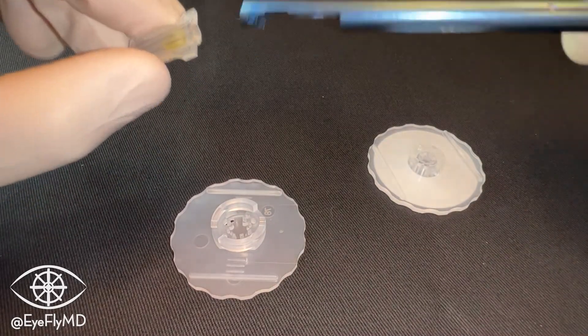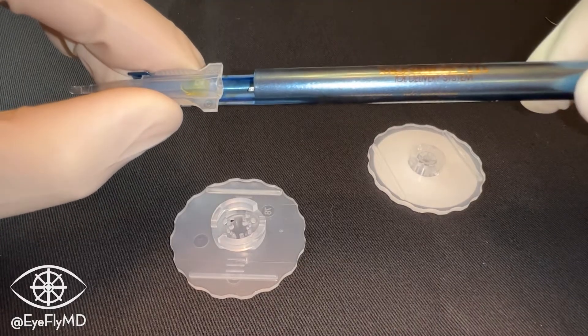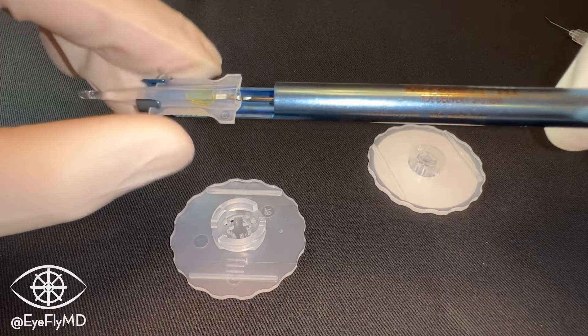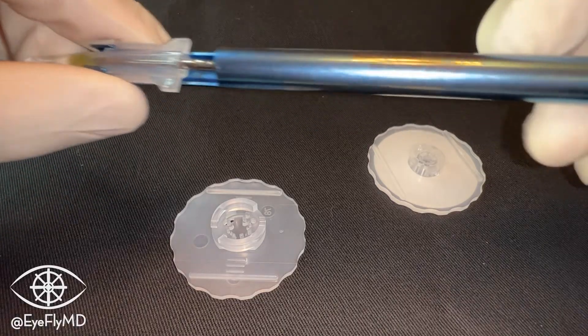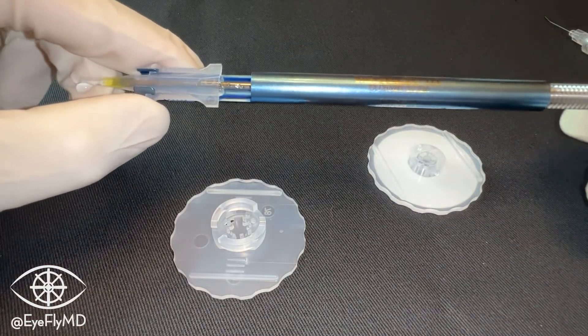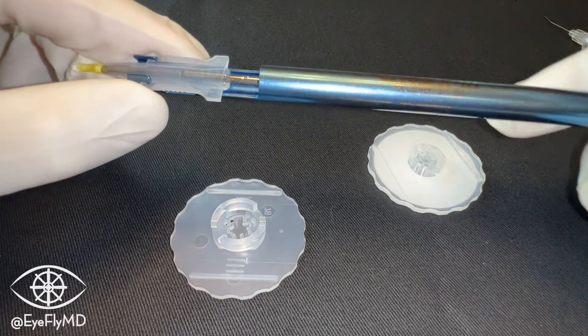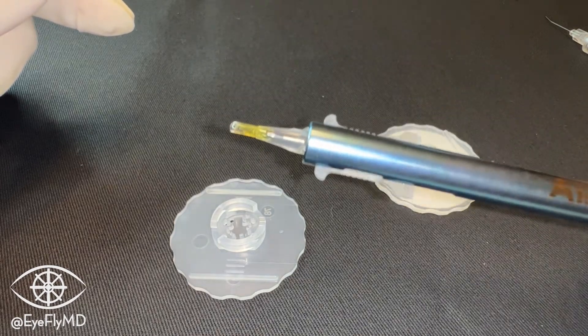We'll take our injector and snap it into place — we should feel and hear a snap. As we advance the plunger, we can see it's starting to push the IOL through the cartridge. We'll push that down until we can engage the screw portion at the top, and once we engage that screw and start twisting, the IOL advances in a much slower, more controlled way. We advance it until it gets to the edge of the cartridge, and now it's ready for implantation.